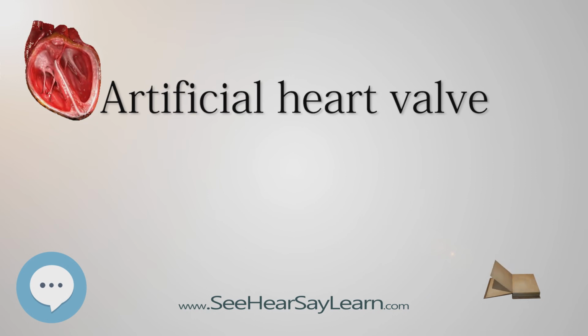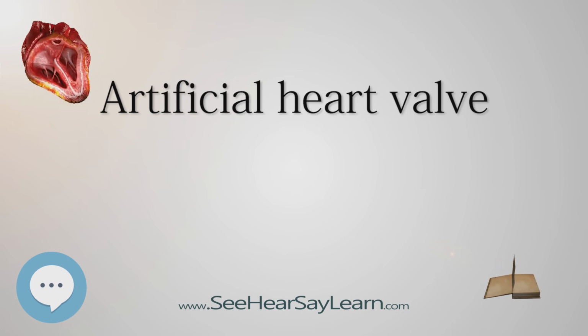Due to the noise created by the contacts between the moving ball and the cage, the ball was later changed to use silicone-coated material. The first implantation of a mechanical heart valve to a human was performed by Dr. Hufnagel on September 11, 1952, using the valve that he developed. This event accelerated the development of other artificial heart valves.